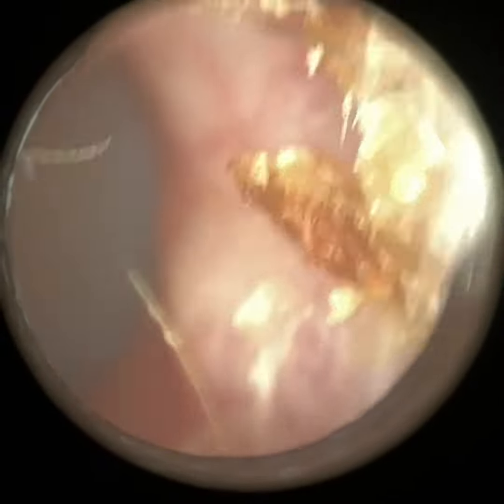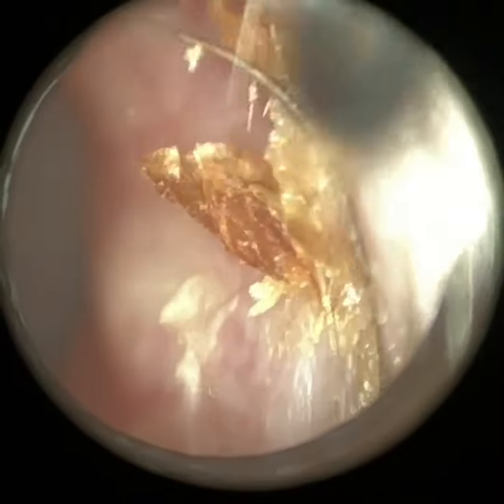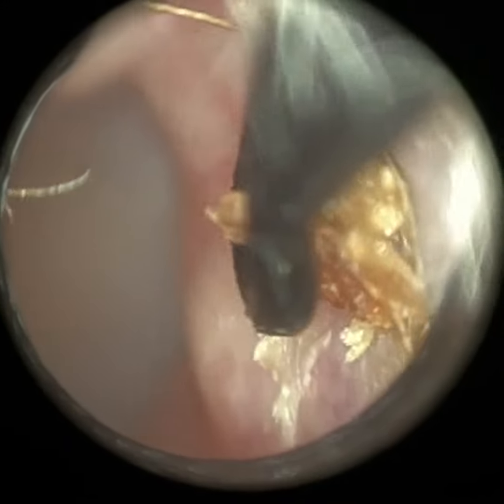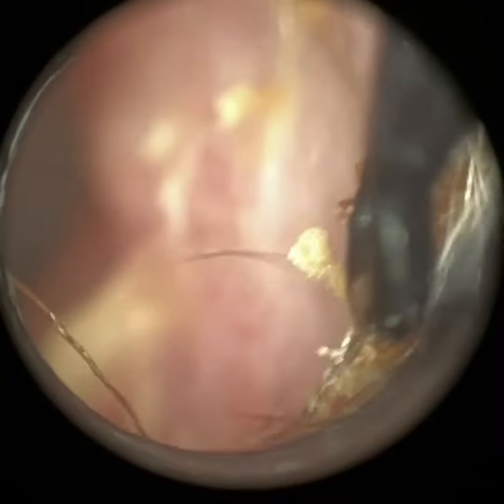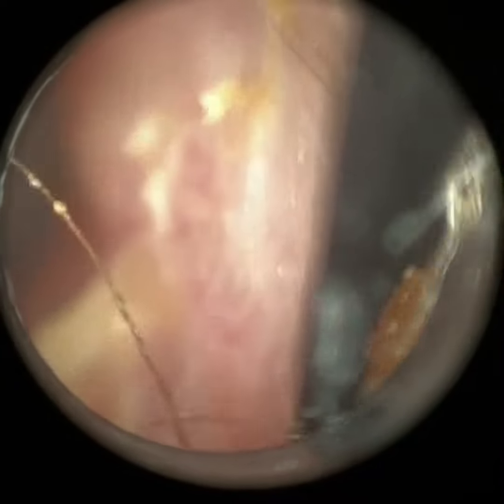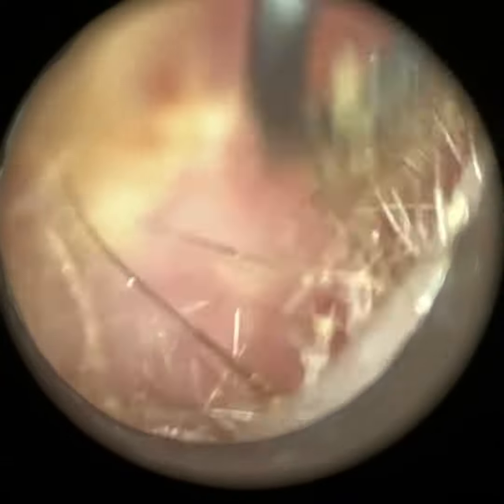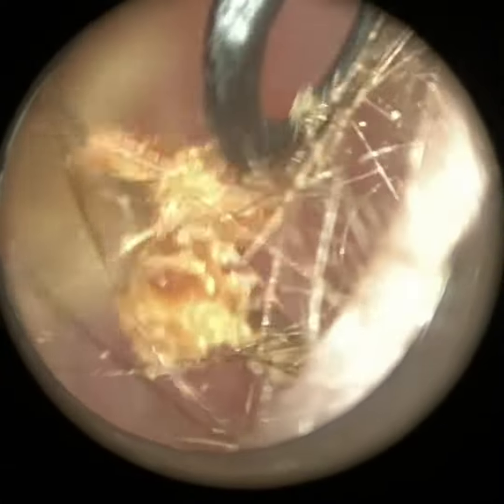Sometimes they can be misdiagnosed as osteomas, which are singular, typically bony growths. Although this patient has got two or three superiorly, there are also some smaller exostoses developing on the bottom right of the ear canal and bottom left.